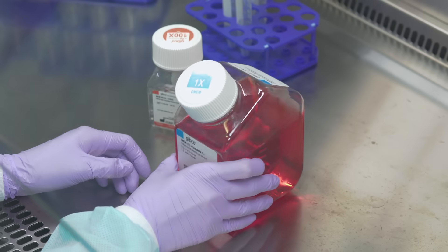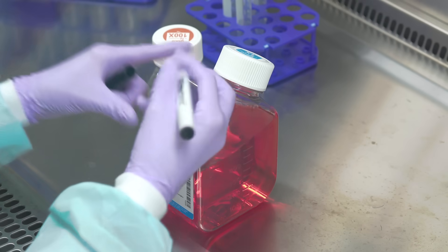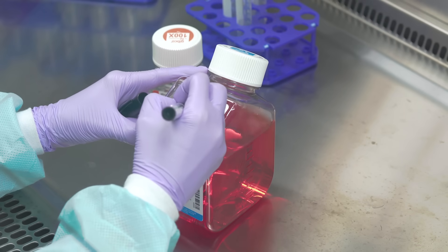Gently mix the contents after supplementation. Labeling the bottle after supplementation is a good laboratory practice.